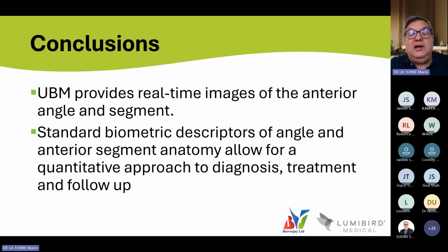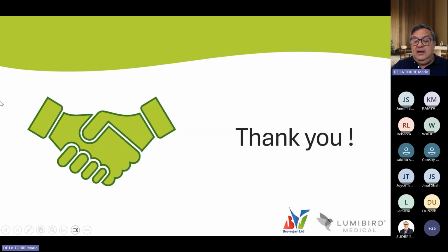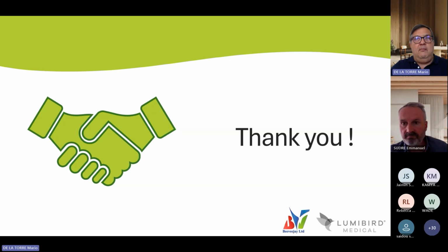UBM provides real-time images of the anterior angle and segment. The standard biometric descriptor and angle anterior segment anatomy is very, very well seen, and it allows for a quantitative approach, first to the diagnosis, then to the treatment and the follow-up. Thank you so much. Yes, to give my take-home message.